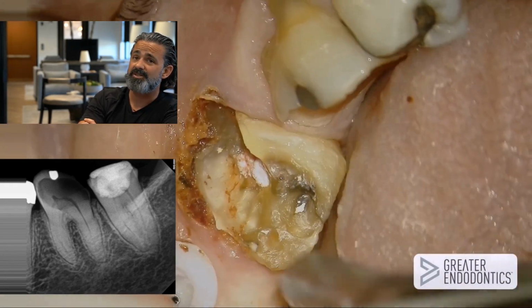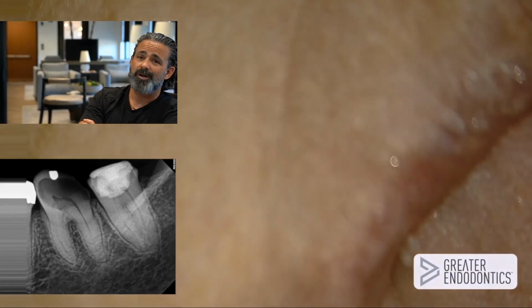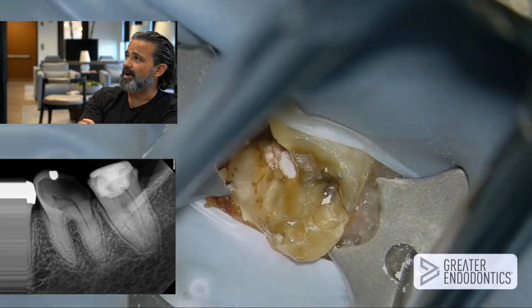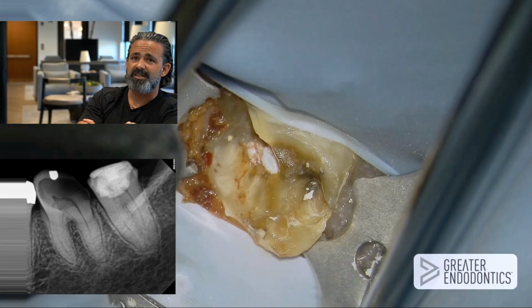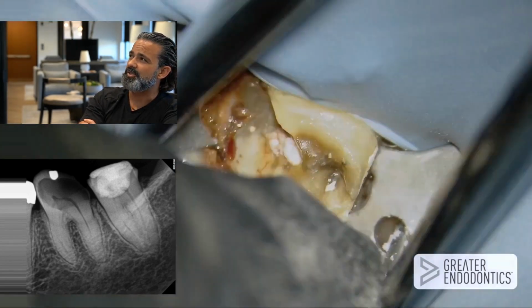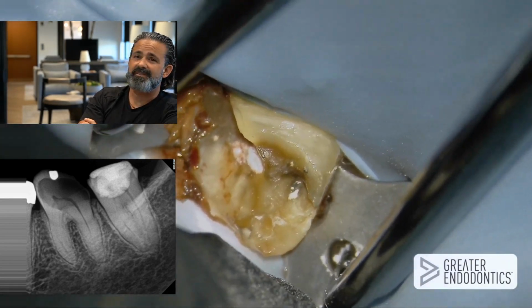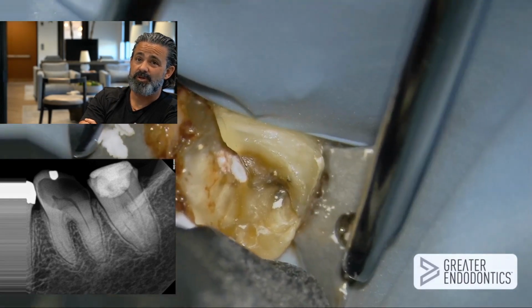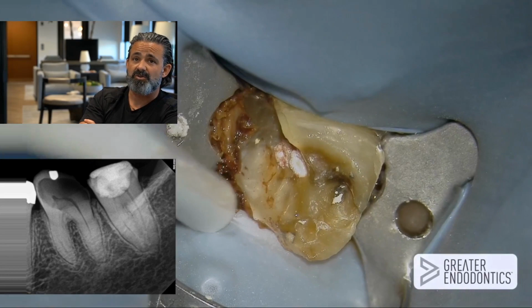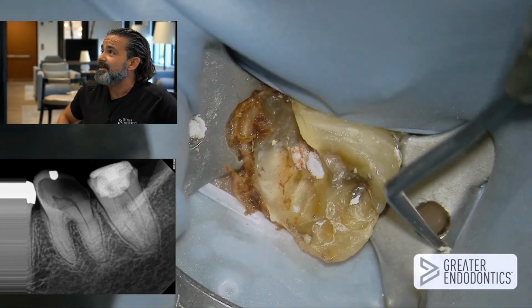Now, again, remind you, the dentist already told me he's putting a crown on it, and we're going to be having a crown lengthening conversation here. So now that I've adjusted the gum tissue, didn't really remove osseous tissue, just worked with the gum tissue so I could get a better seal around the tooth, I'm going to see if this 2AS, so it's serrated, clamp can get me a nice, tight, strong, solid, single tooth isolation. Say that 10 times. So that's what I'm doing.